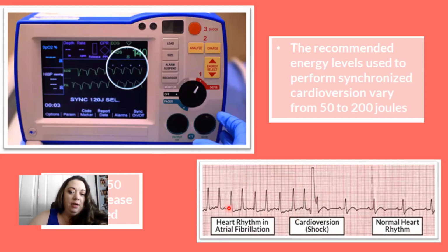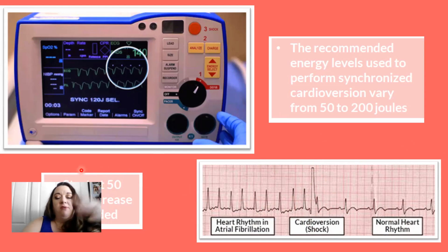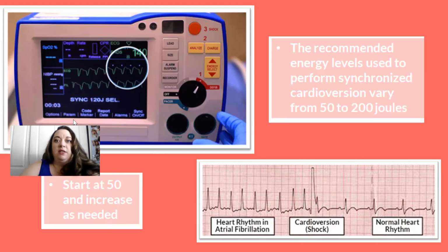So that's what this picture is down here. You can cardiovert AFib. I have never seen it; we usually control that with medication. But down here I do have what looks like AFib RVR. You can see there's a big discharge, high voltage from us shocking the patient, and they convert it into a normal rhythm down here. So that's all cardioversion. You can cardiovert different rhythms, but more often than not it's going to be SVT. Any questions on that?